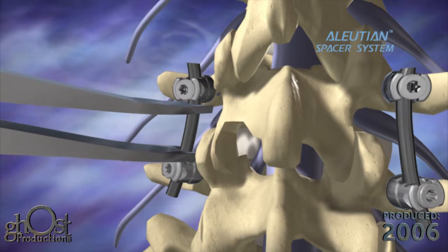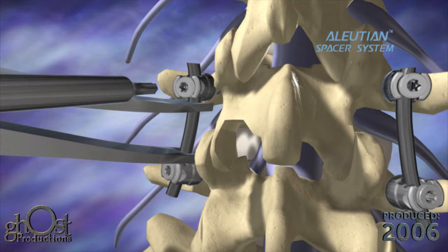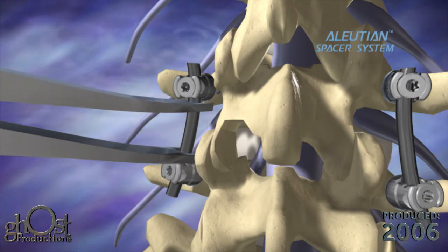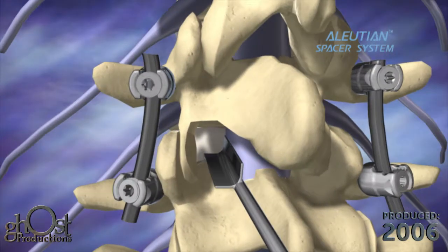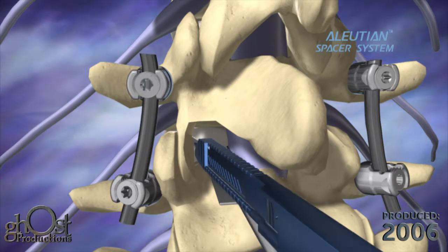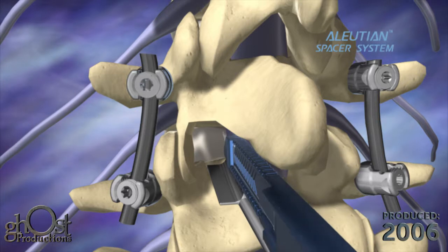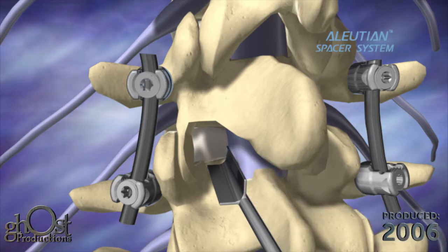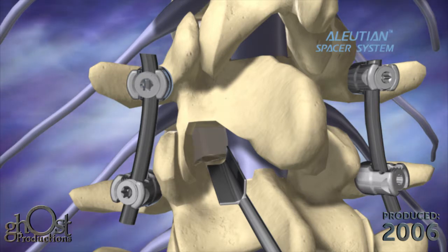At the surgeon's discretion, a lamina spreader or K2M distractor may be used to open up more space for access to the disc. Using any combination of nerve retractors, the cauda equina and nerve are mobilized to expose the annulus of the disc. Using a scalpel, an incision is made to the annulus of the disc, and the discectomy is performed as needed using appropriate surgical instruments.